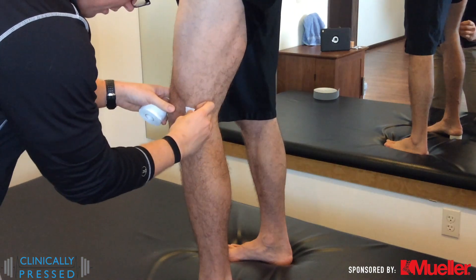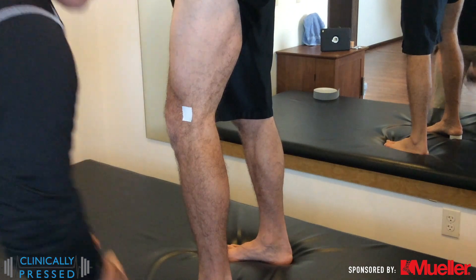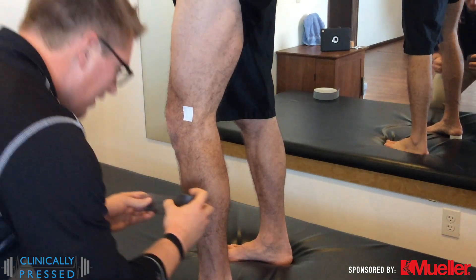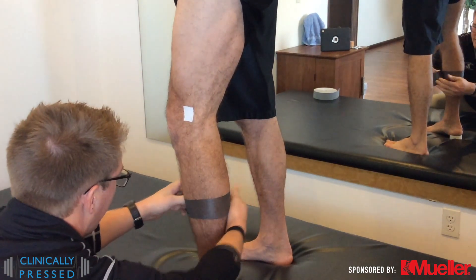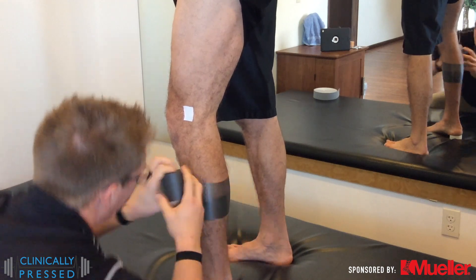When possible, I like to utilize just a little piece of tape almost as a target to make sure that we're hitting exactly where we're trying to go with the crisscross of the support — right over the LCL or the MCL.